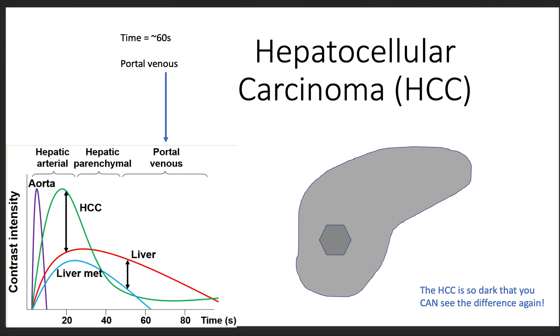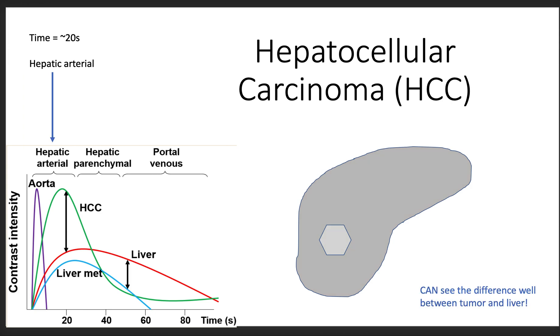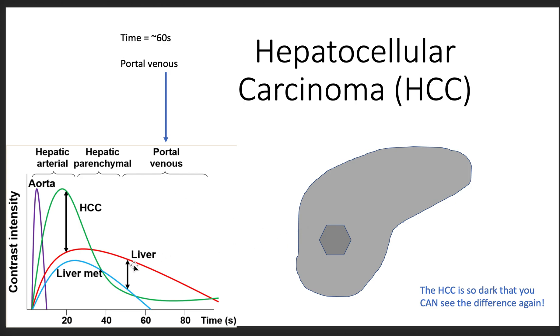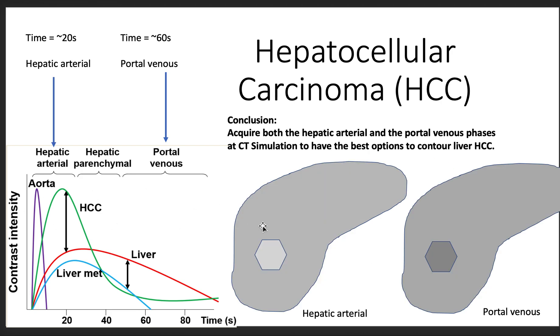Reviewing that: no contrast, everything looks the same. In the arterial phase, things are brighter and we can see a big difference between the HCC and the liver. Between the arterial and venous phase, the HCC is not as easy to distinguish. In the portal venous phase, the HCC is much darker than the liver and we can see a big difference. In conclusion, for hepatocellular carcinoma, you want to acquire both the hepatic arterial phase and the portal venous phases at CT simulation to have the best options to contour liver HCC, using scans from each phase to ensure all components of the HCC are covered.